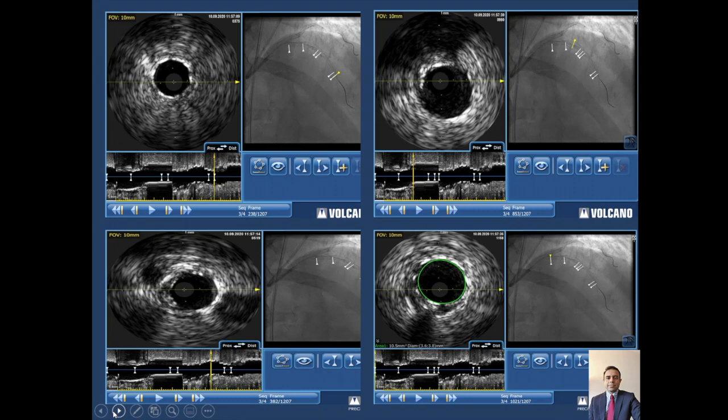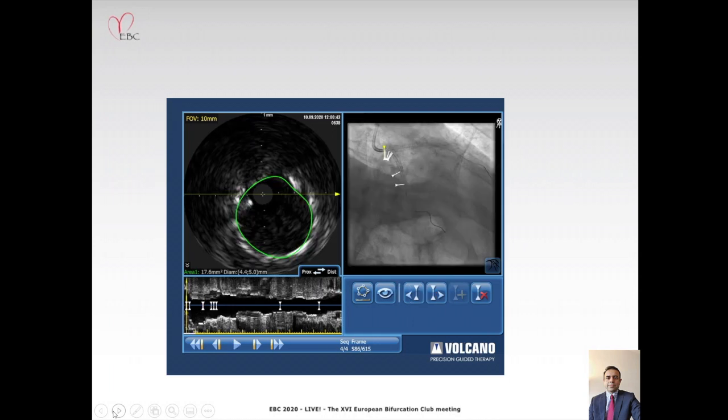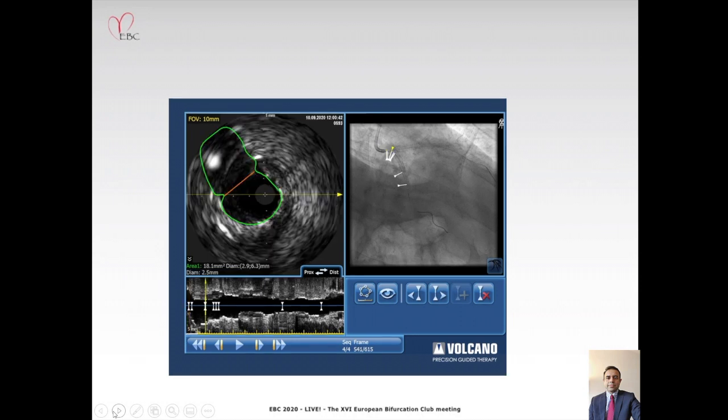Yeah. And then clearly, this has been published previously by Ziad Ali and the group in European Heart. And so in that first report, they were using FFR, but with your Philips system, iFR, and also then echocardiography to ensure that you haven't got distal vessel perforation and things of that sort.